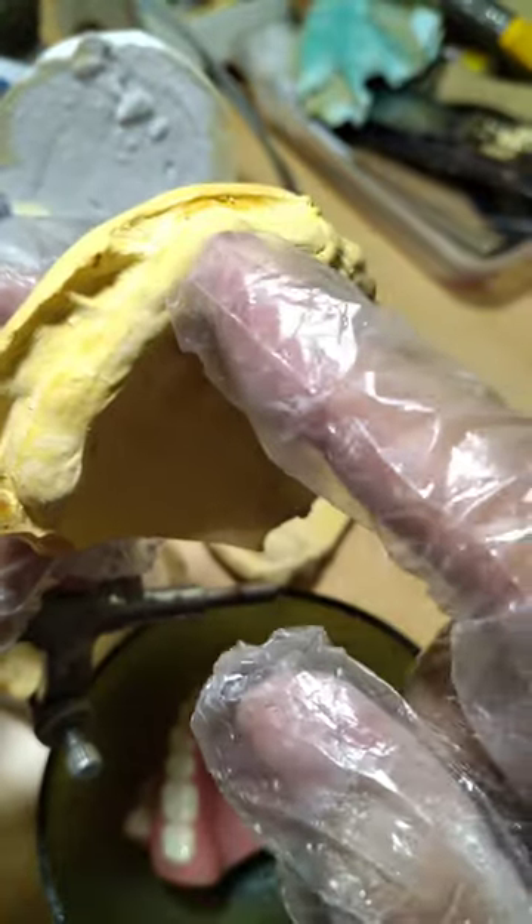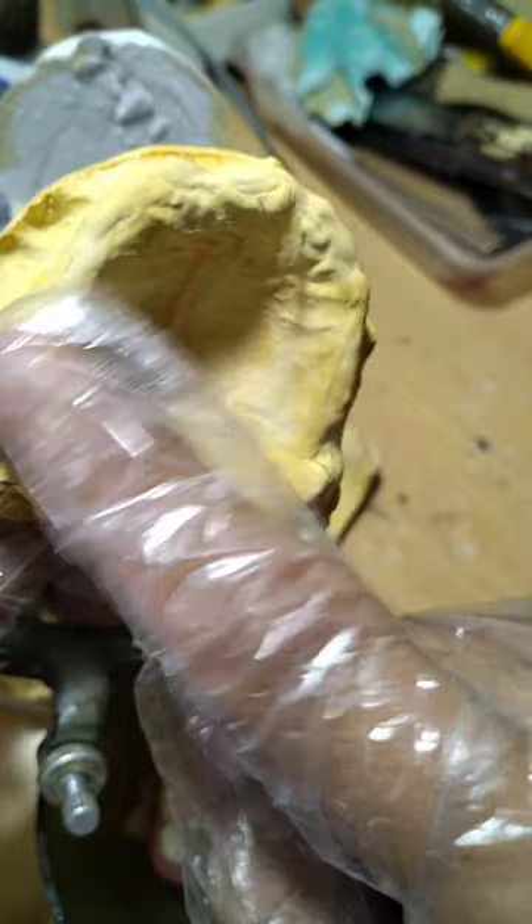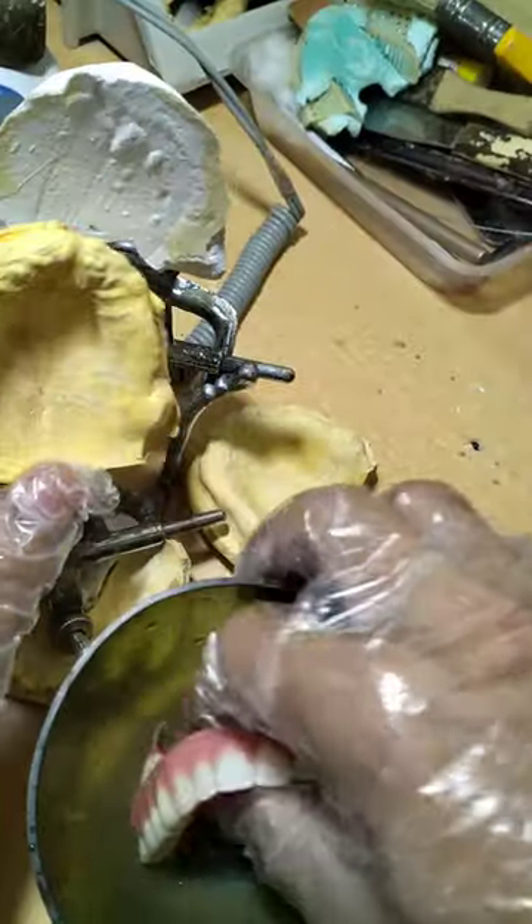Kailangan mo may mga implant — siguro dalawa o apat. Depende kung paano idi-discuss yan ng doktor. Pero kadalasan apat — dalawa dito, dalawa dito. Apat.